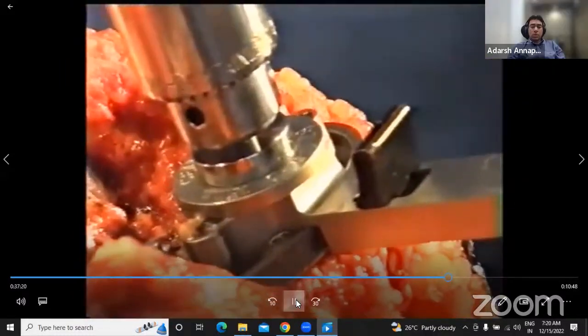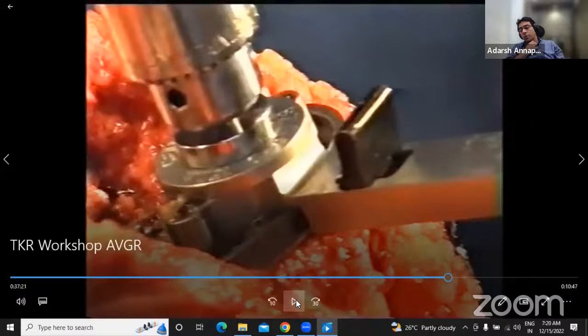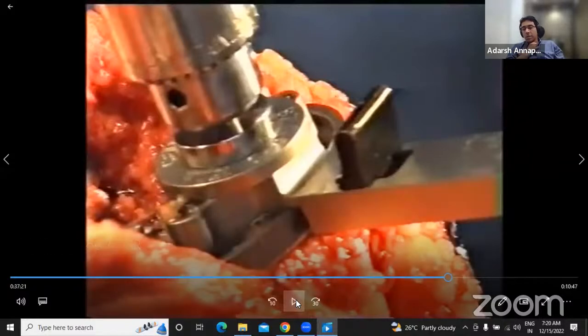So here he has shown two out of the four methods that we discussed the other day about tibial rotation. One is matching the tibial tuberosity, going parallel to Akagi's line. The second is using the drop rod to make sure it's matching the second web space. The third, as Dr. Sahasrar is mentioning, is the free floating technique. And the fourth is the anatomical method, where you match the shape of the anatomy of the tibial base, the tibial plateau. Four methods.